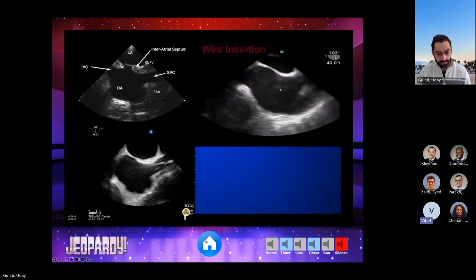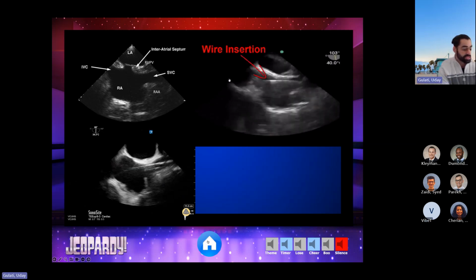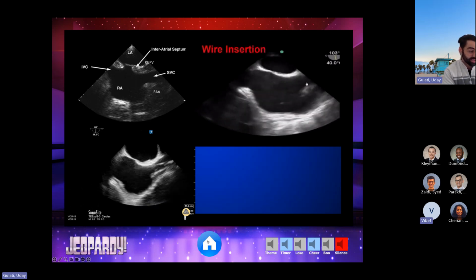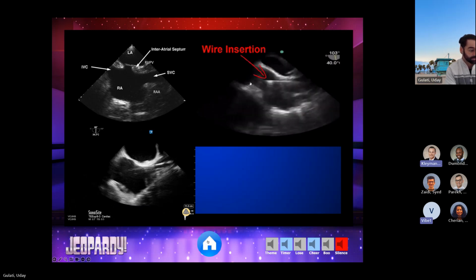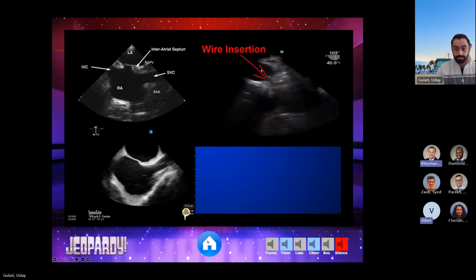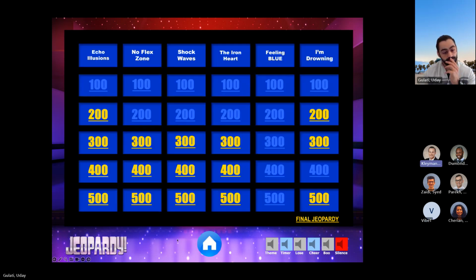And generally, is that going to be about 50 centimeters from the femoral puncture site? So this is the thing, these are all estimates prior to an ultrasound. I don't really care about the number now because now I can see the catheter correctly. The biggest thing is knowing it's not only placement, it's positioning too, where your drainage cannula is, where the flow is directed. Because even though you have it in the atria, you may not be directing the flow appropriately, and then you're not going to have a good drainage.